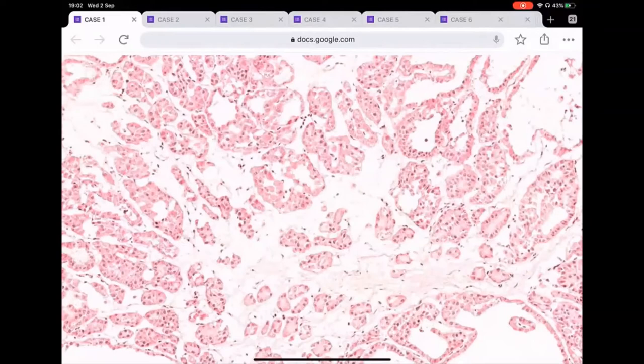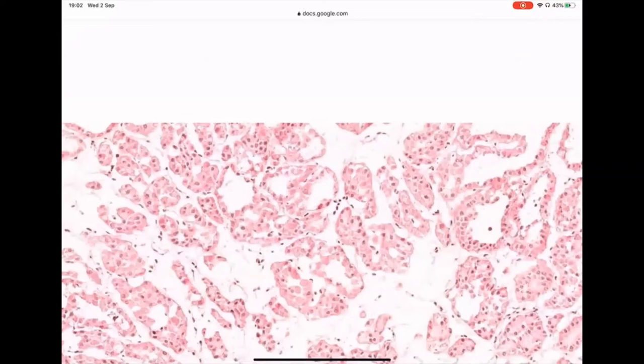So some of you said oncocytoma. Does the majority agree with this? Just say yes or no, or okay. So we have some agreement on that. Okay, so this is a very straightforward case, and this is the easiest.